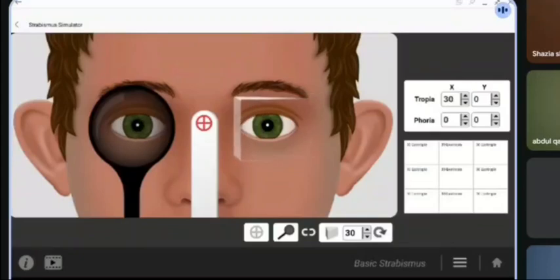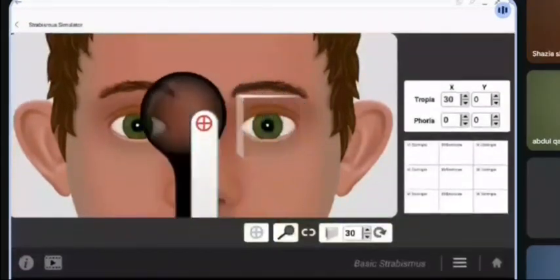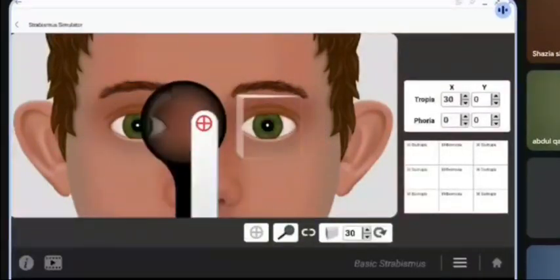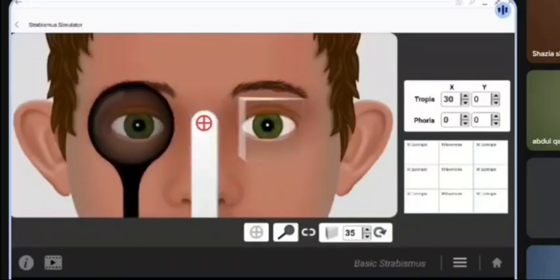Now I'm placing the prism in front of one eye. Now I'm doing a cover test. So alternate cover test. In this alternate cover test, you can see now there is no movement. This is what our end point should look like. For a cross confirmation, you can increase the prism diopter once again, place it and do an alternate cover test.